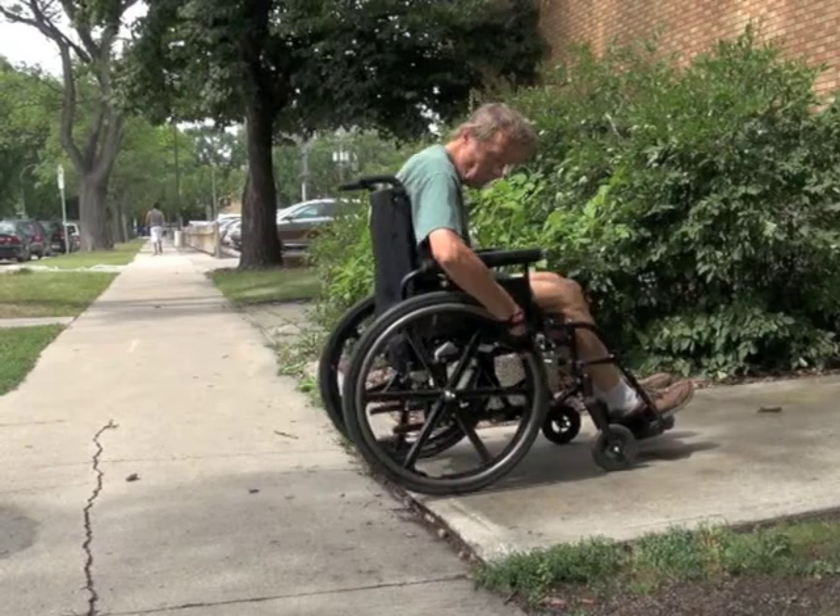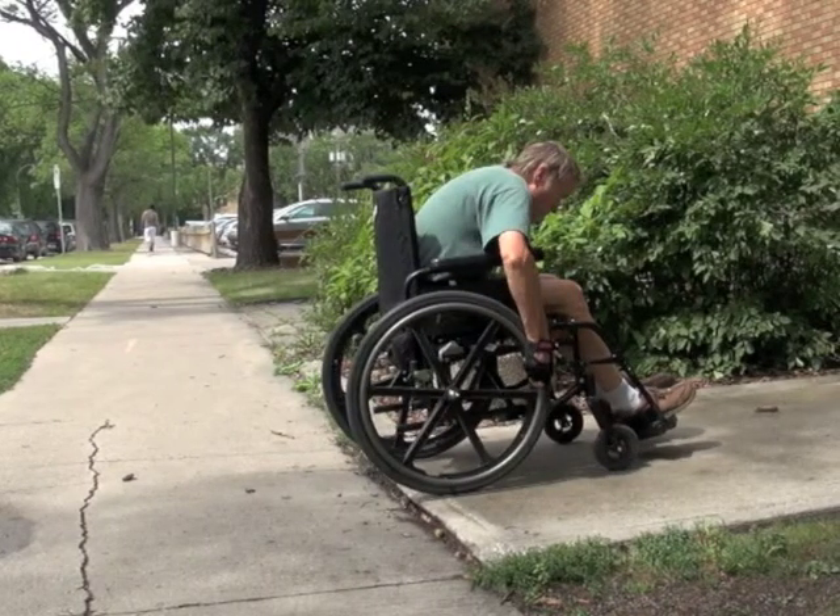Keeping your bum back in the chair, lean forwards as far as you can comfortably and grip the push rims far out in front of you. You will need to keep your trunk forwards throughout this skill or the wheelchair will tip backwards.